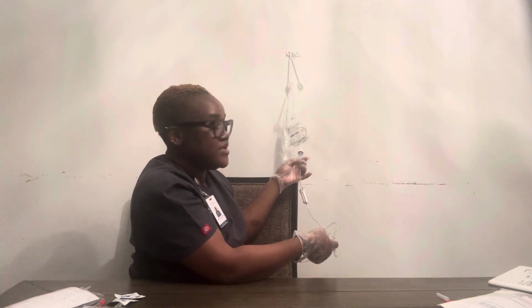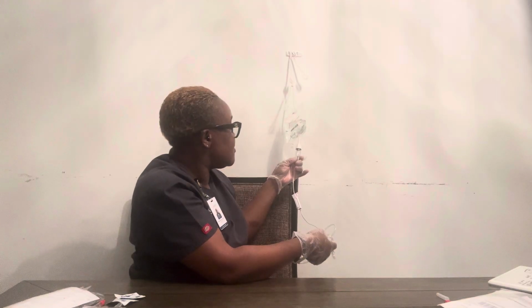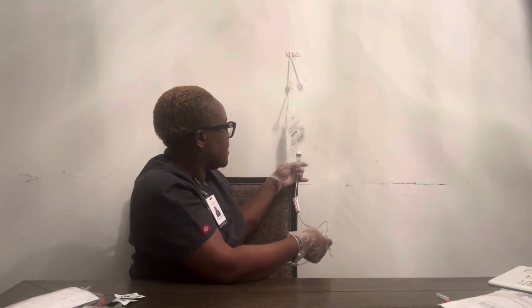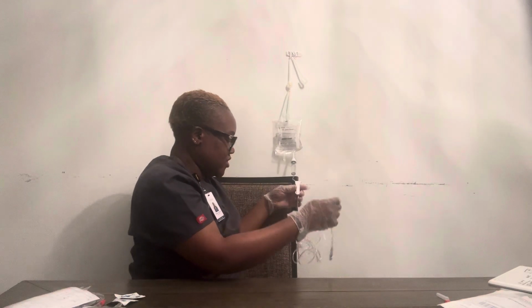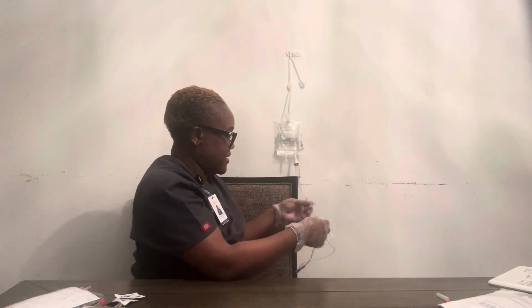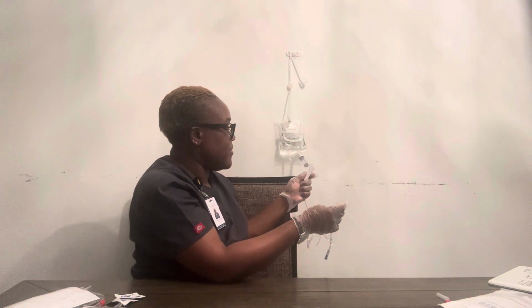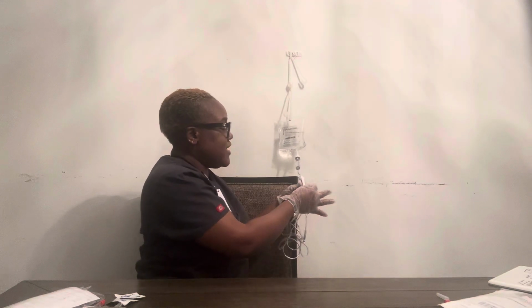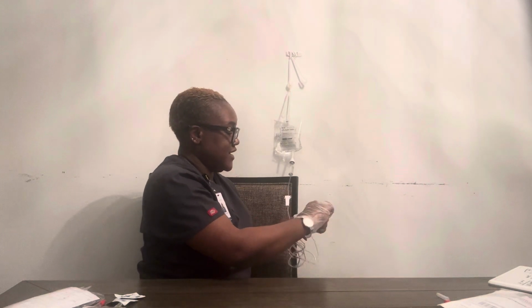I'm gonna squeeze my drip chamber until it's half full. Okay, and now that it's half full, I am gonna open my roller clamp so I could prime my line. I'm gonna allow the fluid to drain.